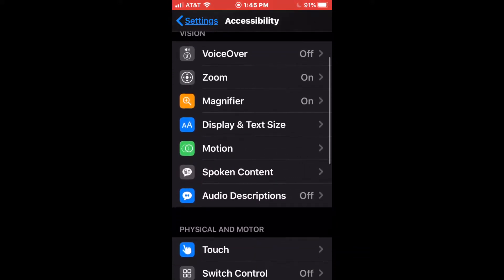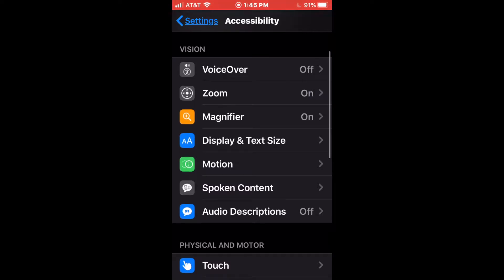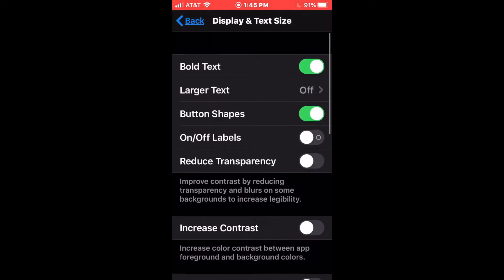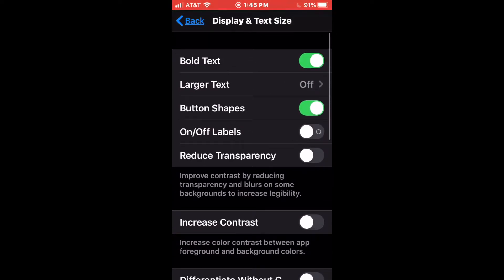In accessibility, we have all of the accessibility options which are available to people with disabilities. And some of those are going to be specific to vision — those will actually be the first ones in the list. There's a number of different things. The ones we're interested in at the moment are going to be zoom. And we could also look at display and text size. Actually, let's look at that first. So we'll go into display and text size.